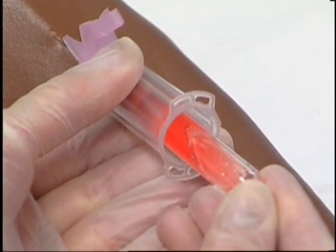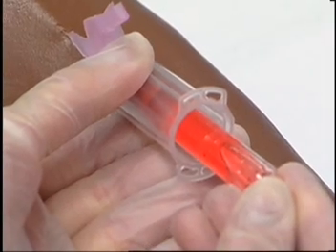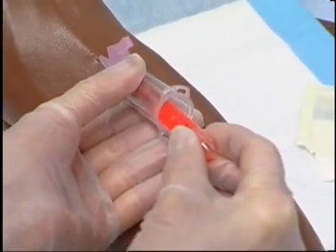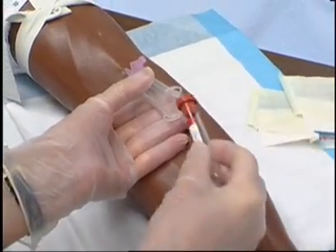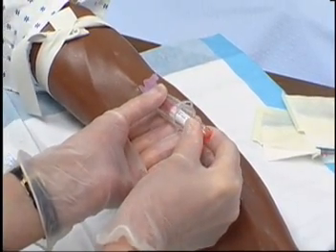If you have entered the vein correctly, blood will now spurt quickly into the tube. When filled to desired level, release tube and set it aside. Attach another tube to vacutainer or prepare to remove needle.